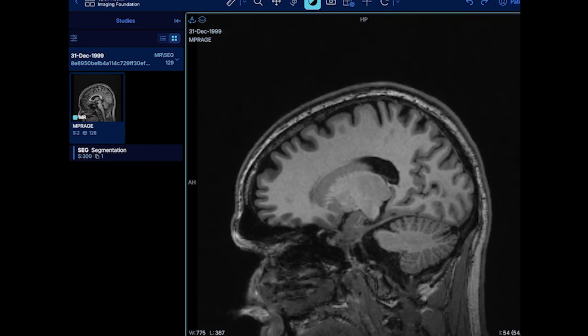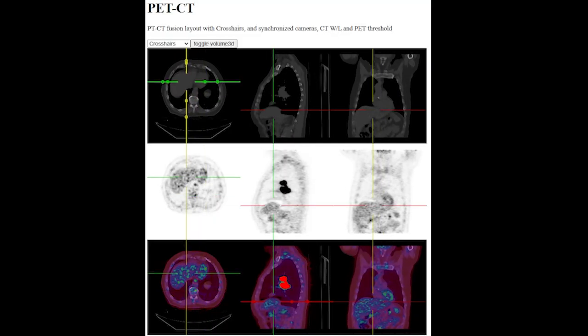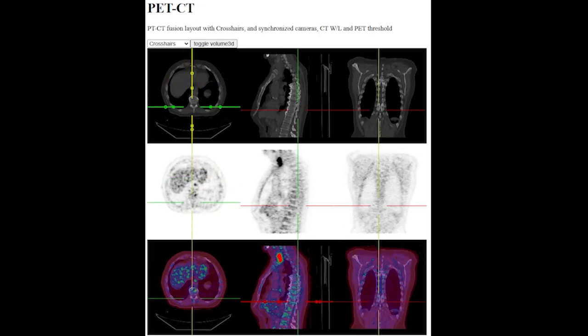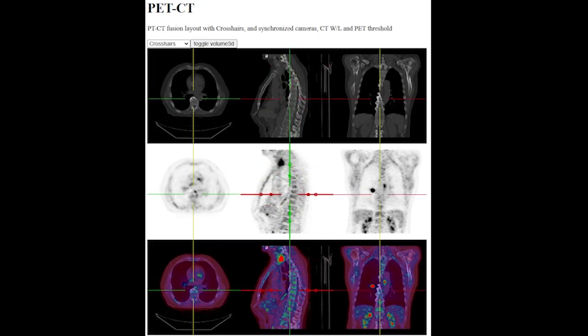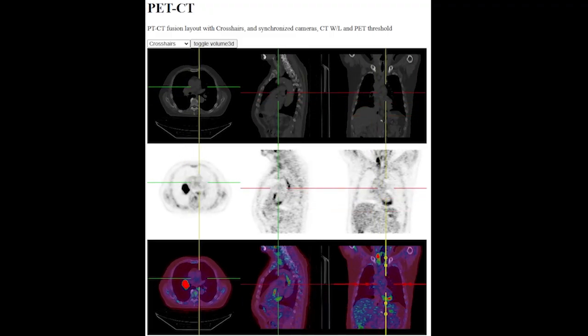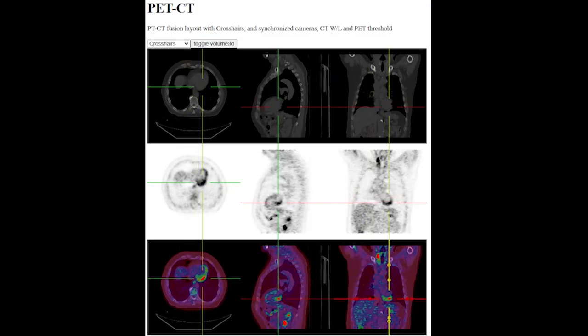Integration with existing PACS, RIS, or EHR systems where appropriate. AWS is the secure platform layer. The clinician does not navigate buckets, lambdas, or step functions. They use a familiar imaging workflow portal, while the MSP operates the underlying cloud controls, audit trail, and cost boundary.